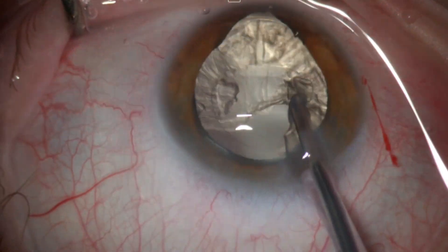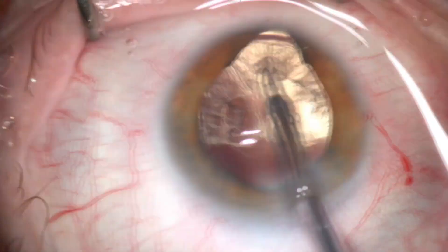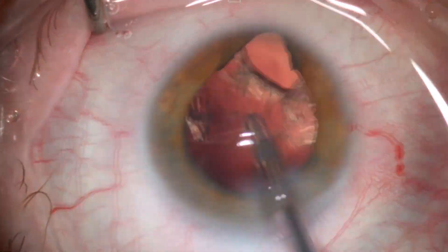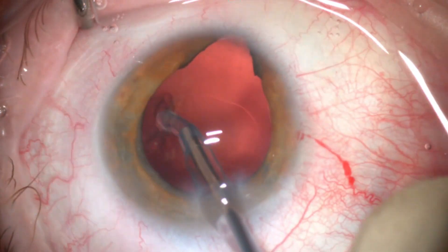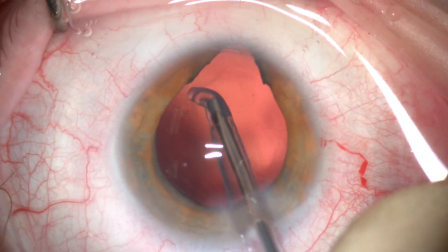Cortical removal was performed using a soft silicone tip. It's a really efficient way of removing the cortical matter, with special attention to avoid any tension on the area of zonular dehiscence. The changes visible in the red reflex are mainly due to the chorio-retinal coloboma.